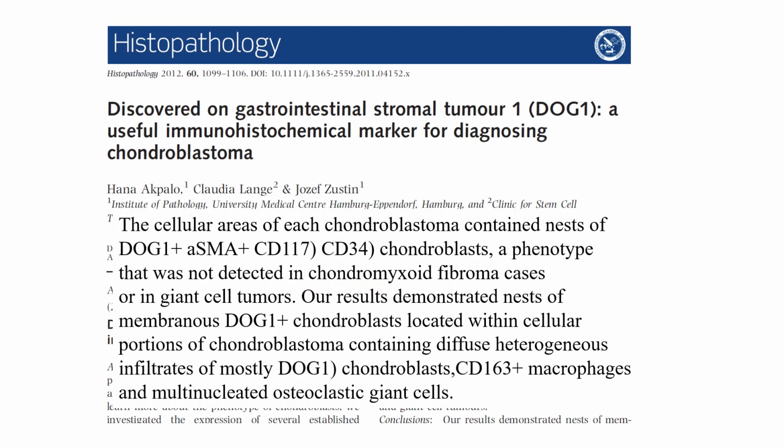New molecular studies described by H. Akpalo and colleagues show that some of the chondroblastomas may express DOG1 stain, which may be useful in some cases to distinguish from giant cell tumor or chondromyxoid fibroma cases.